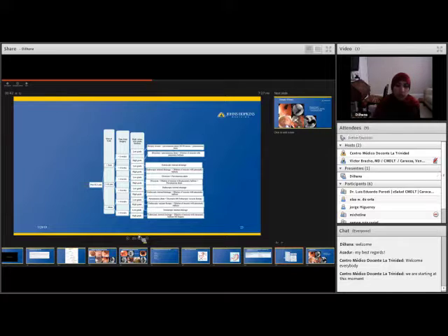As the size of the leak is bigger, so more than 10 millimeters, or if the patient has had this leak in place for more than 6 weeks, then it becomes quite difficult to manage these patients. And often these patients with high-grade leaks that have been there for more than 6 weeks, they will need endoscopic maneuvers. So the things that we use are endoscopic vacuum therapy as well as endoscopic internal drainage.